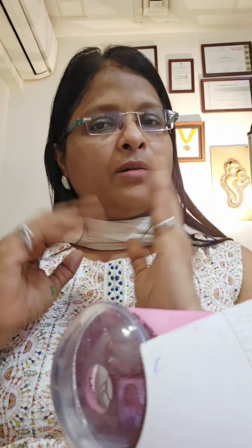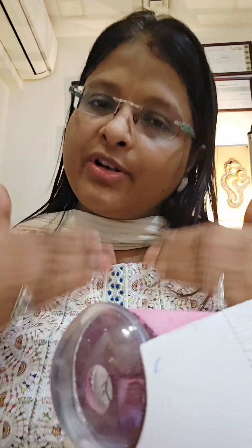So these are the lenses that we have. Then we have toric lenses, when the person's cylindrical power is in a particular axis and it is more than plus or minus 1. At that time we counsel the patient for a toric lens. This gives you spectacle independent vision if you put a toric lens, which neutralizes that axis. So you don't have to use that cylindrical power in your glasses post operation. So again you get spectacle free vision. These toric lenses we get in monofocal, multifocal, trifocal, EDOF, extended monofocal, in all types.